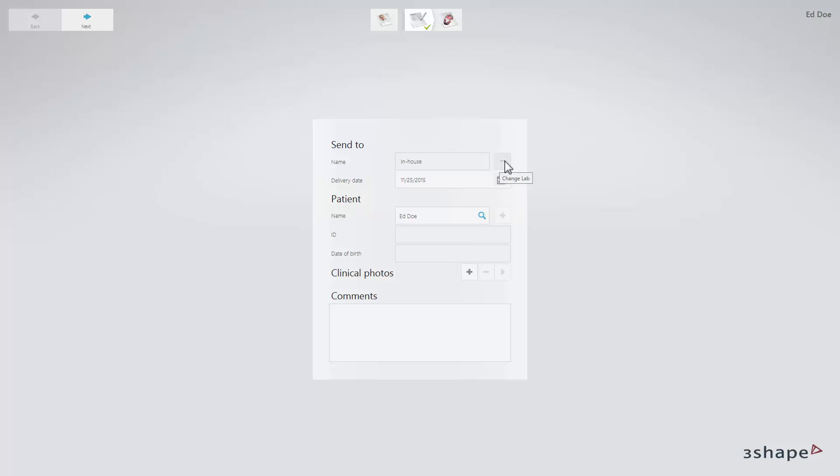When the Indication Settings page appears, enter the patient's information and add photos and comments if necessary.